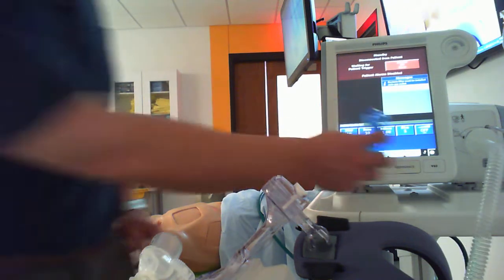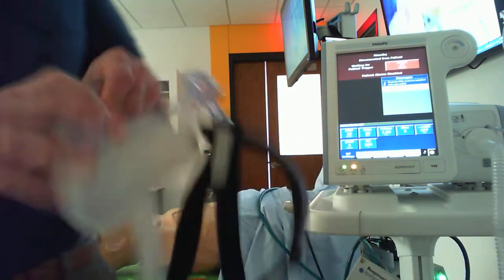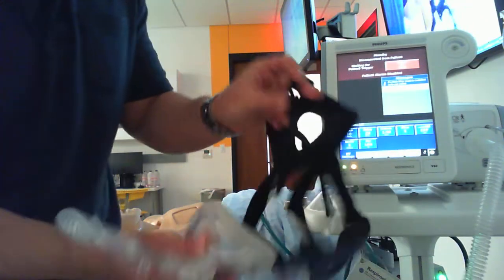All right, putting it back here at the machine makes it very convenient for us, but not very effective for your patient. So I have the proper mask selected here, okay? I am going with a large on this patient. What I recommend is getting all these straps nice and loose.